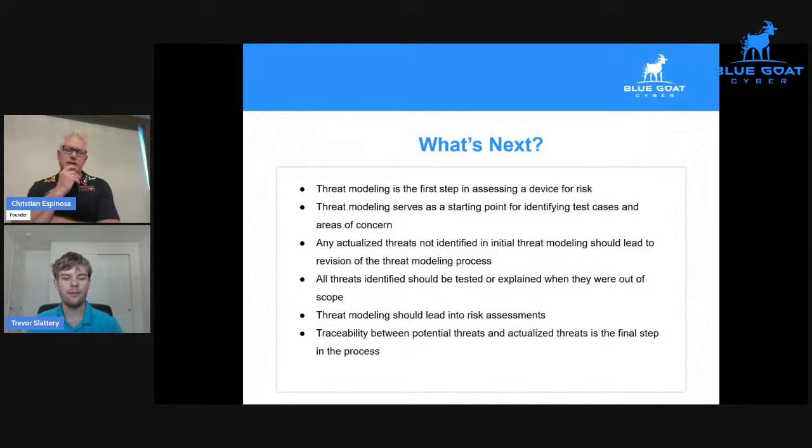So, and that's a good point. Like I just had a conversation with a prospect a couple of days ago, and they were frustrated with a cybersecurity company they hired because that cybersecurity company was recommending all these generic cybersecurity controls for a critical device that a surgeon needs access to. They're trying to tell them they needed multi-factor authentication, and like you said, these long passwords.